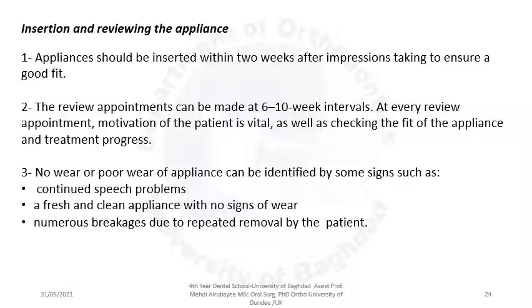Third, no wear or poor wear of the appliance can be identified by some signs. If the patient didn't wear the appliance during the last month, this can be discovered by a good clinician. This is shown by a continuous speech problem, because the patient was not tolerating speech with the appliance, having left the appliance out for a long time.